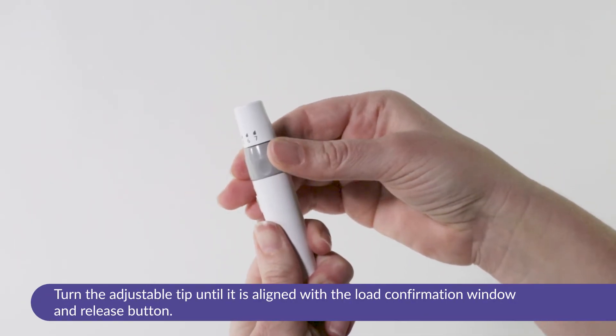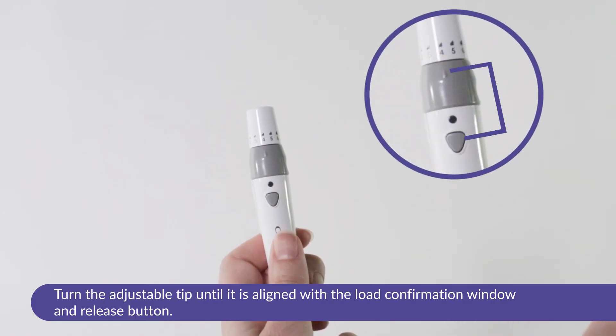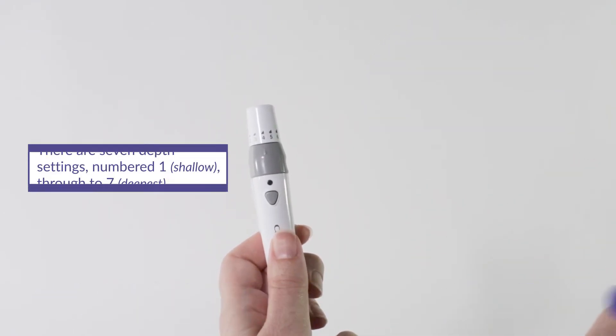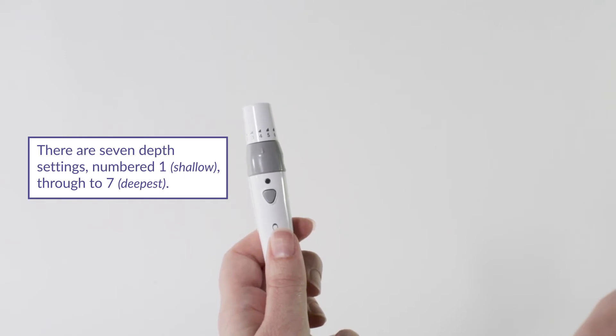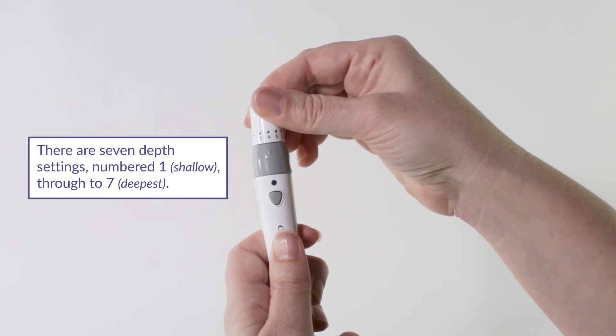Turn the adjustable tip until it is aligned with the load confirmation window and release button. The lancing device has seven depth settings numbered one, shallow, through to seven, deepest.